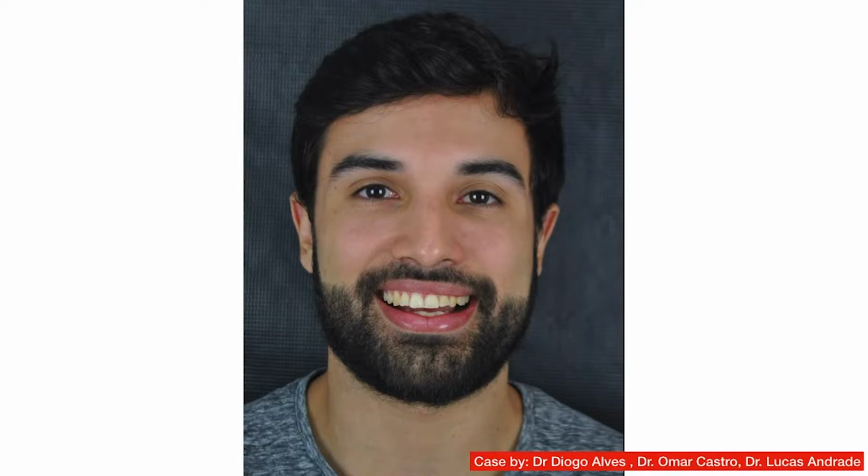All right, so this is our patient, a young man, 26-year-old, who came to our dental office in Brazil, Angra. And due to the nature of his profession, he wanted a treatment option that was quick and effective. His main complaint was a dissatisfaction with the harmony of his smile, and he also complained about the fractures of the incisal edges and the dark shades.